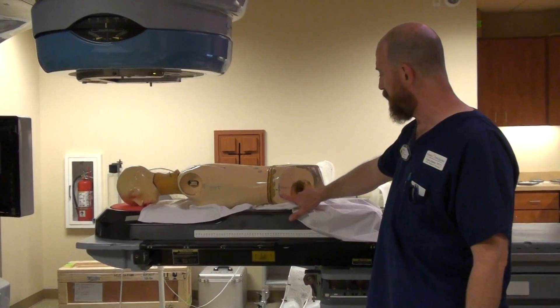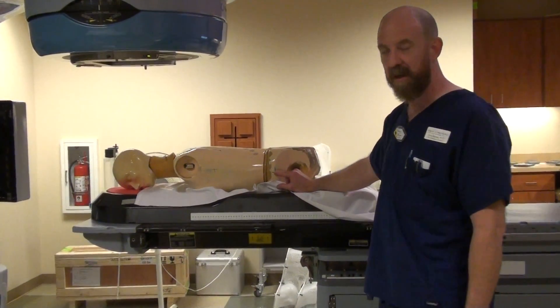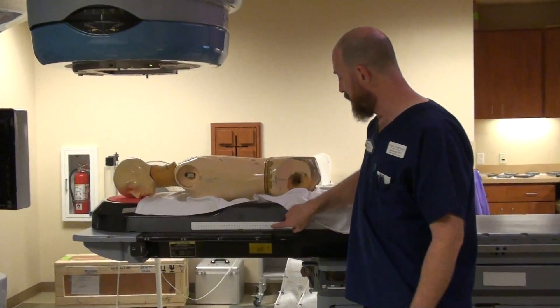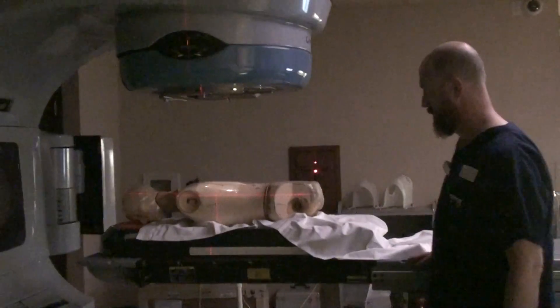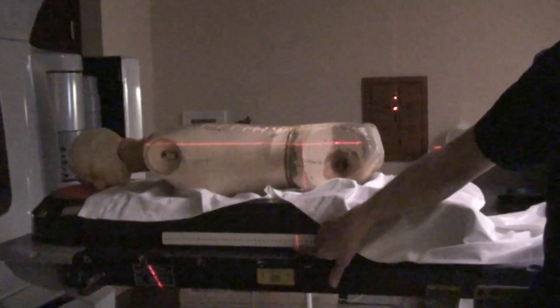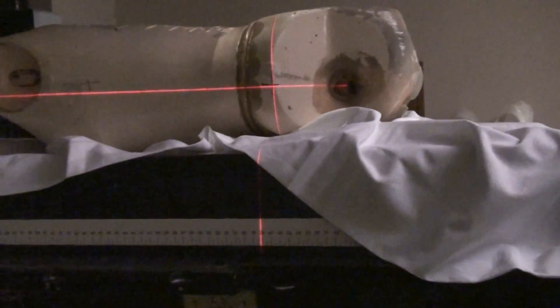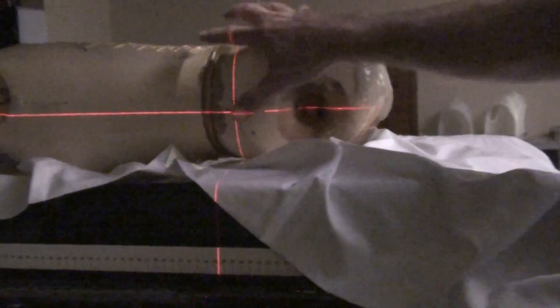There's an index on the side of the board. In simulation, once they get the mark put on the patient, you want to know in-out right where the patient was in sim, so you'll be given a number. You want to make sure that when you have the patient lined up, they're within one or two centimeters in-out of that particular number. In this case, we're lined up with 28 and we're lined up with the tattoo. Don't get too tied up in making sure you're on exactly 28 — if she's a little bit forward, it's not the end of the universe. This is a range so that she's grossly on the table in the right spot, as opposed to being at 38 or 24.